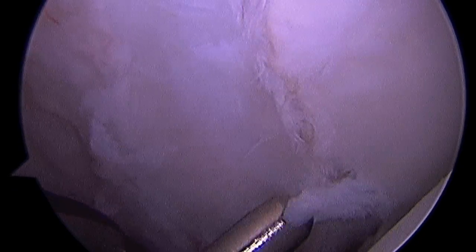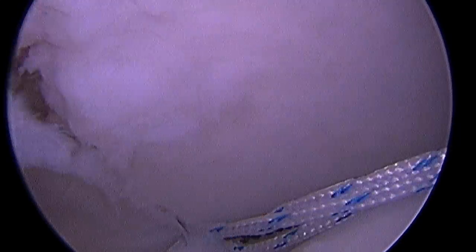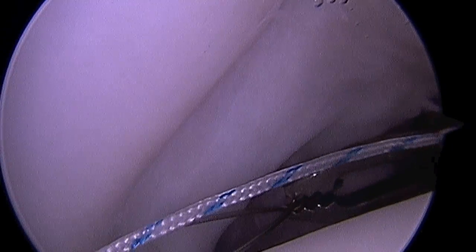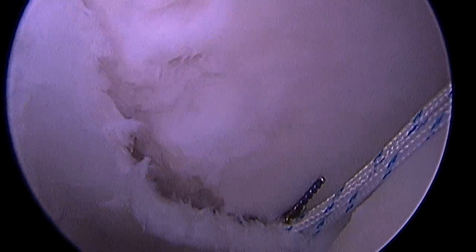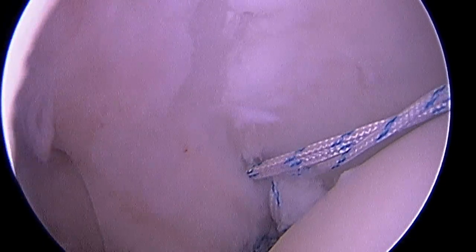There you see my first anchor going into place. I'll pull on the stitches a little bit to set the anchor. And then we'll use a special suture passing device to pass each arm of the stitch through the labrum and the capsule or ligamentous complex. The art comes in knowing just how much of that capsule to take in order to tighten up the shoulder appropriately without tightening it too much. There you see that second arm of suture being passed through. What we're doing here is establishing horizontal mattress sutures — I think those are the best because it prevents the sutures from abrading against the cartilage with shoulder motion. Here's the second anchor going into place. We'll usually put four to five anchors on a posterior repair. We pass each arm of that suture through the labrum and posterior ligaments.